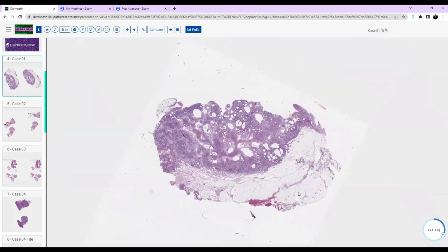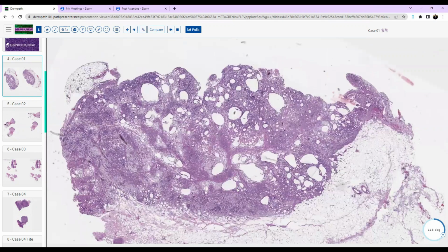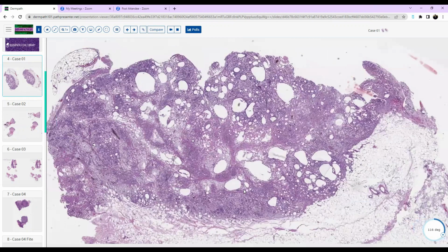Yeah, I can start this one. This is Caroline. So I thought that this looked like maybe an enucleation of something that's well circumscribed with lots of fat or adipose cells and foamy looking cells from low power. So you favor an inflammatory process or more of a neoplastic process? I was thinking probably a benign neoplastic process.